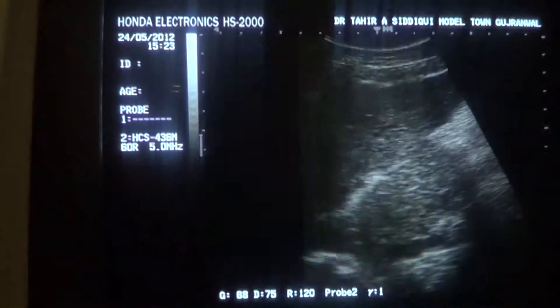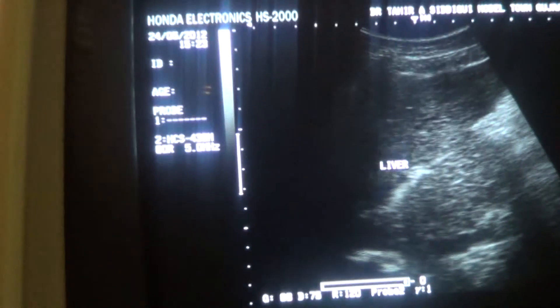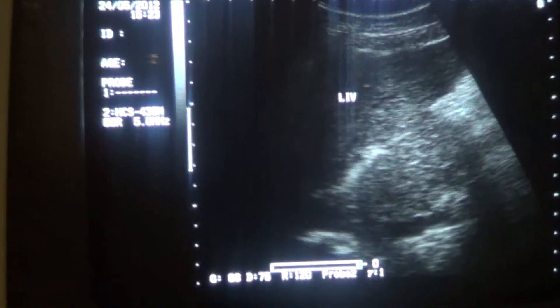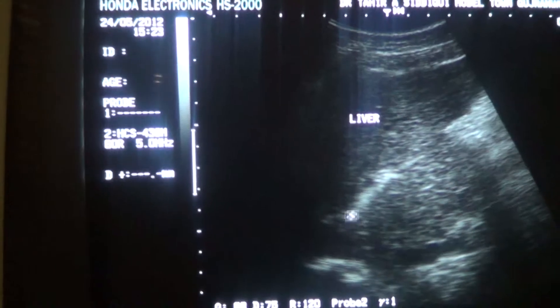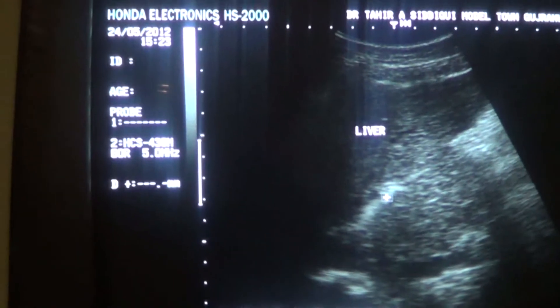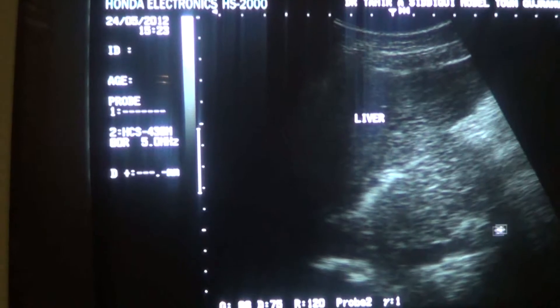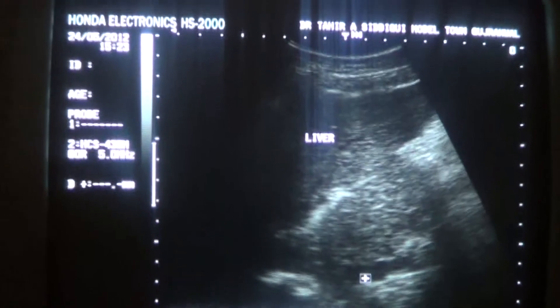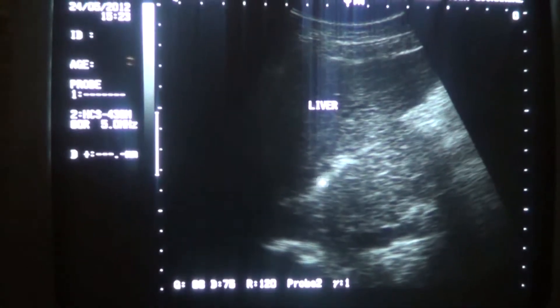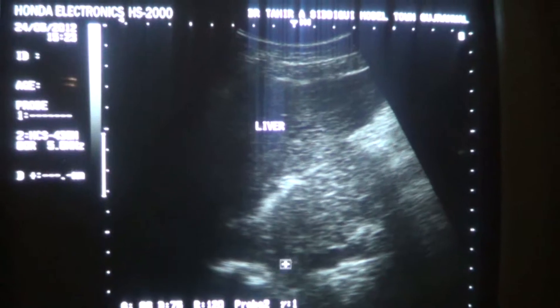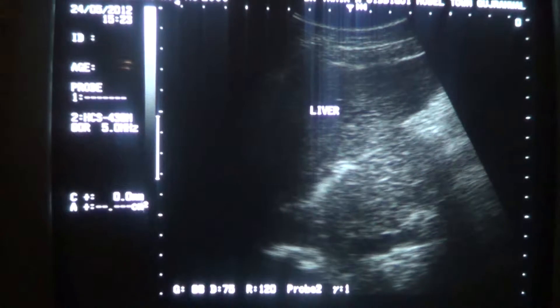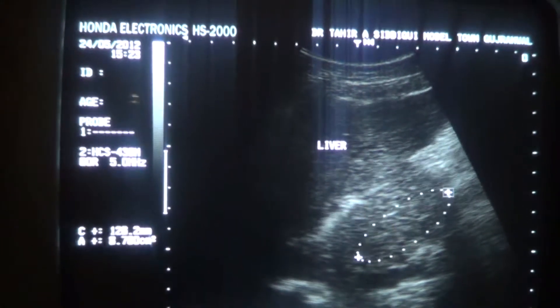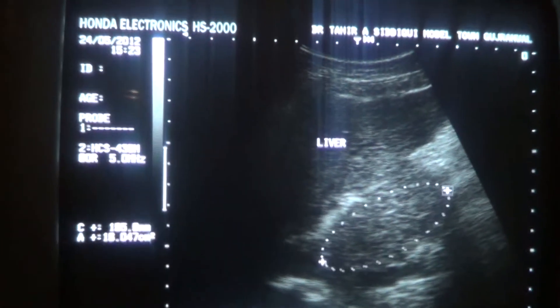This is the caudate lobe of the liver. And this linear structure is the ligamentum venosum. This is the inferior vena cava. The area bounded by the ligamentum venosum anteriorly and the IVC posteriorly is the caudate lobe of the liver, and you can see it is showing hyperplasia.